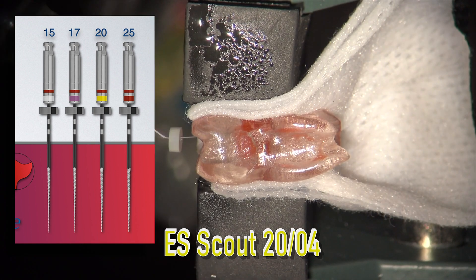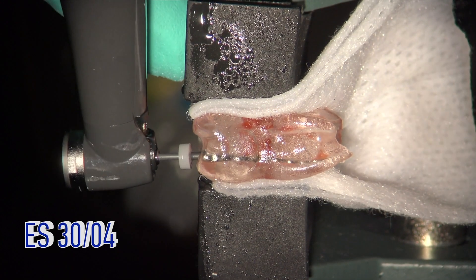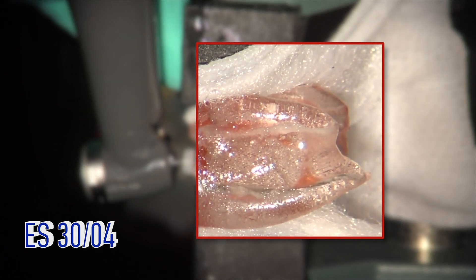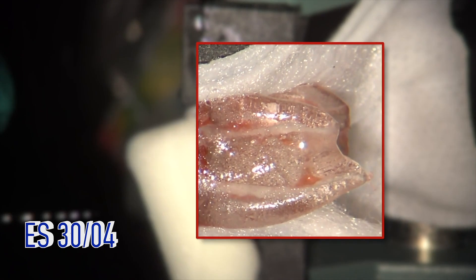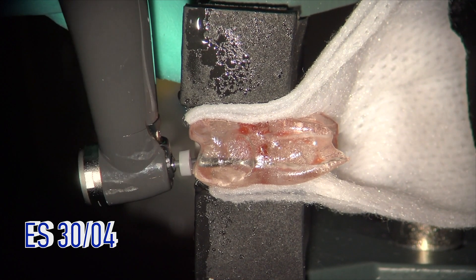Until the first Scout file reaches the apex — as soon as that happens — then you work your way back up until you get to a size 30, which is your finishing file. The key, however, is to make sure you have an open path. You need to recapitulate with your size 10 hand file in between each file to make sure you've maintained the opening of the canal. Once your first Scout file reaches the full working length, move back up in size until your size 30 has reached the apex. Keep irrigating and recapitulating throughout the process to keep it open, as you're using Scout files to gradually enlarge the apex before your size 30 reaches full working length.